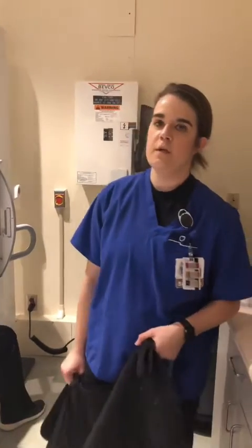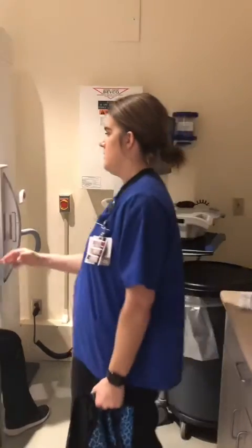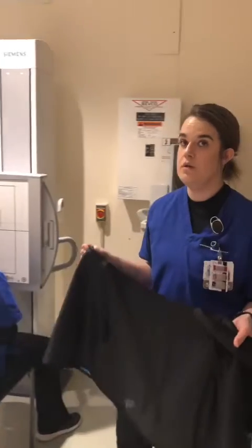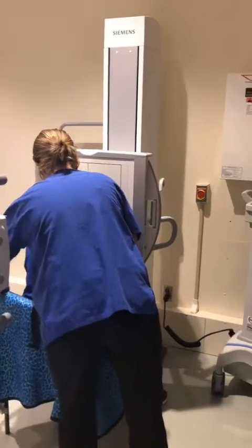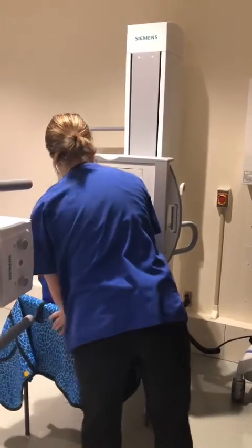Alright, so next we're going to be doing the PA Caldwell skull. So I have the patient seated erect, facing the image receptor. What I'm going to do now is put the shield behind the patient. So I'm going to drape this behind her, have you scoot forward just a little bit here. Yep, sit back.